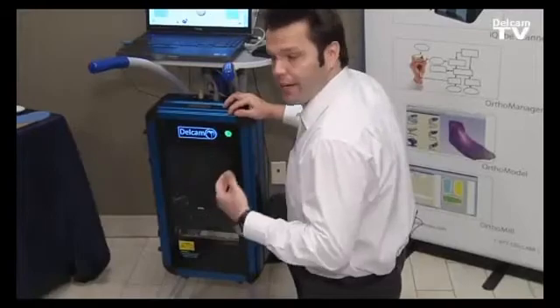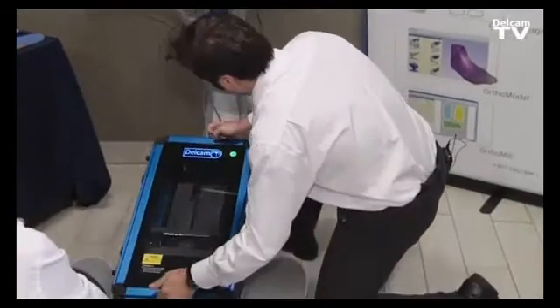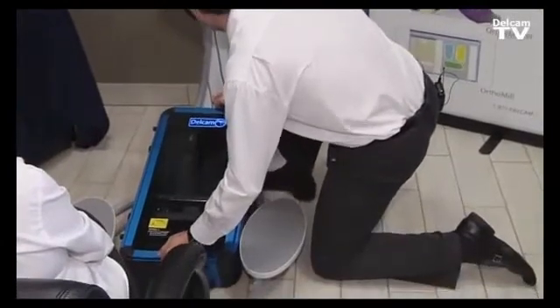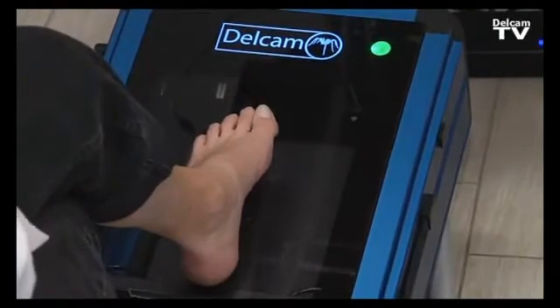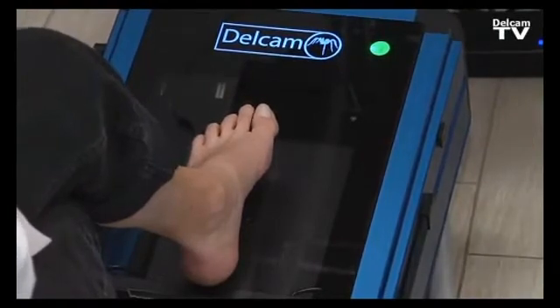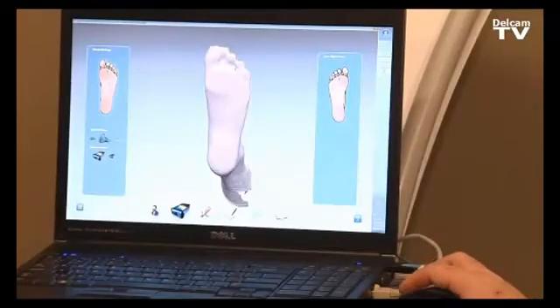From non-weight bearing, we can also do semi-weight bearing scans by just detaching the scanner and moving into the semi-weight bearing position. The patient positions the foot on the scanner and the practitioner can align and hold the foot in position, then simply click to scan either the left or right foot.